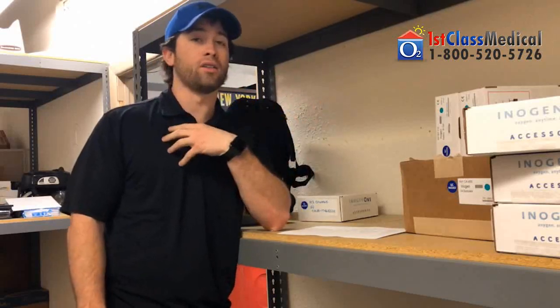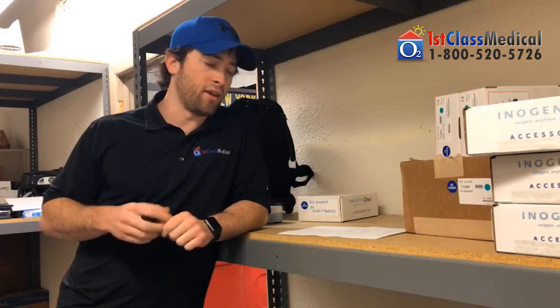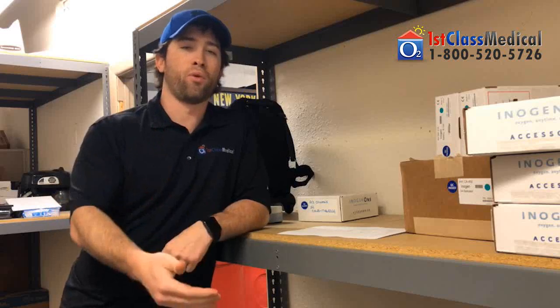The other thing when looking at a portable concentrator, we talked about this, I think it was last week, Lisa, or the week before, was the sleep mode technology. So when shopping for a portable concentrator, one thing we're going to need to know is whether or not you're using a sleep apnea device at night. Because if you are, we can't get you on a pulse unit. We have to make sure you have a continuous flow unit. Just a quick recap of that. Sleep apnea devices require continuous flow in order to what they call bleed in the oxygen. So you can't use a pulse flow with sleep mode technology if you're on a sleep apnea device. So that's one thing that you'll need to let us know. If you're on a sleep apnea device, we need to know that so we know what portable to put you in.